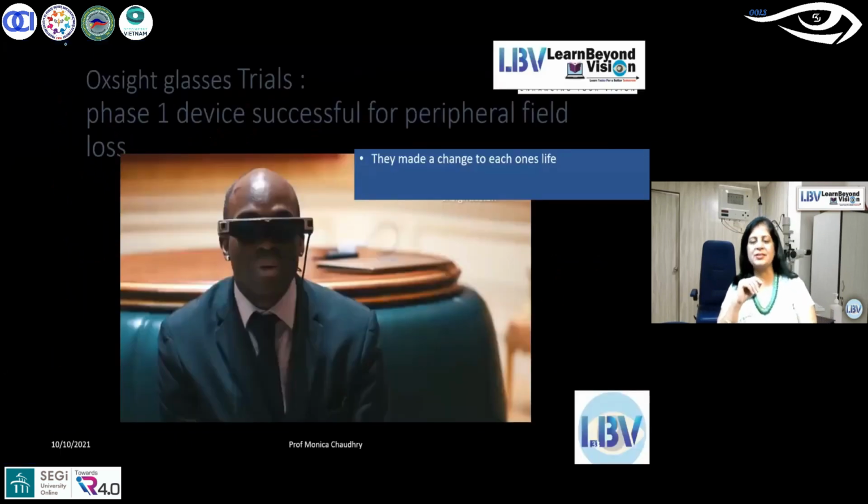You know why I showed you this before I move on to another video, which was on the prototype when we were doing trials? I didn't know it myself. We've always been tuned with our brains to understand visual acuity. For us, it was improving only from 6/60 to 6/24. It doesn't improve much, and we ourselves lose heart on giving the devices. But why I picked this particular video to show you is, even seeing the face, the features, the hair on the face, the color of the t-shirt makes a difference to the visually impaired. We never understood those needs. For a patient, it means a lot.